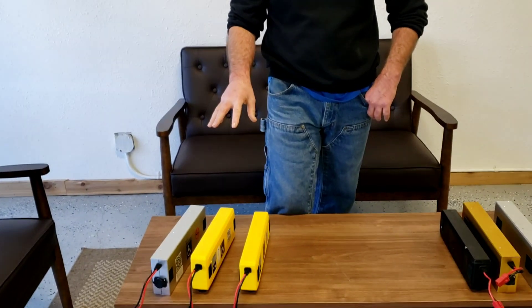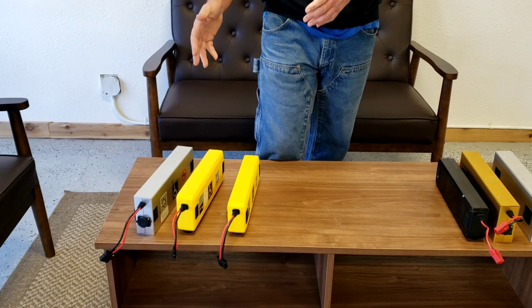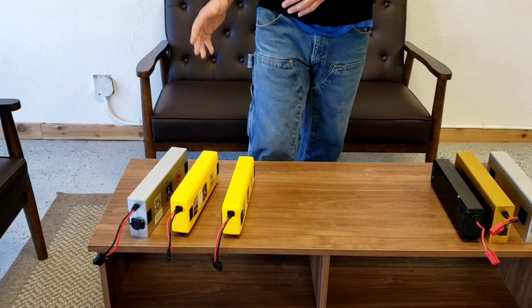Hi folks, this is Tony at TravelScoot, and in this video I'm going to show you our currently available lithium-ion batteries for the TravelScoot.